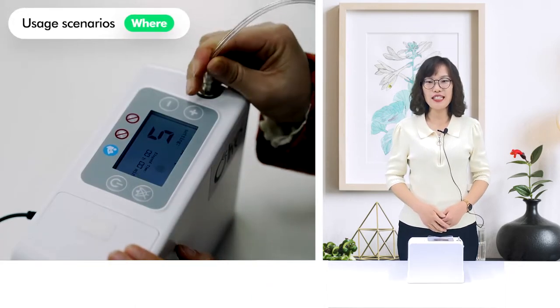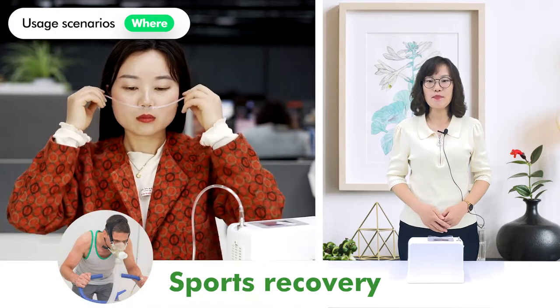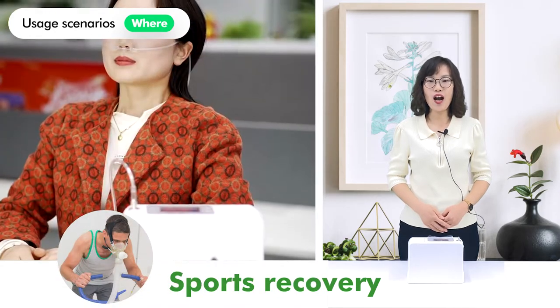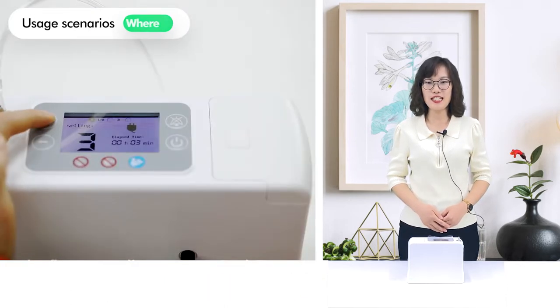Whether you are using it for medical treatment, health care, sports recovery, or high altitude travel, it can meet your continuous oxygen needs.